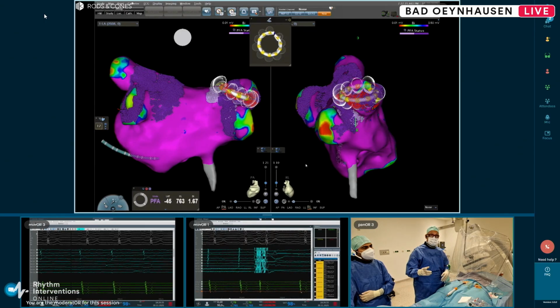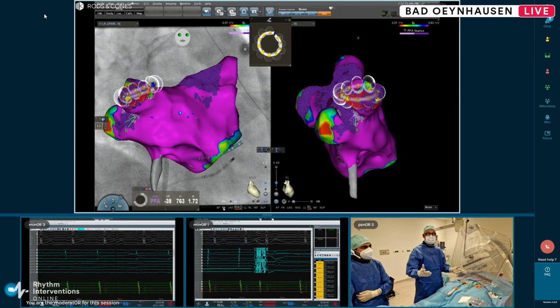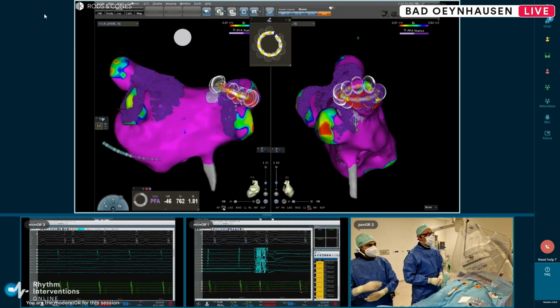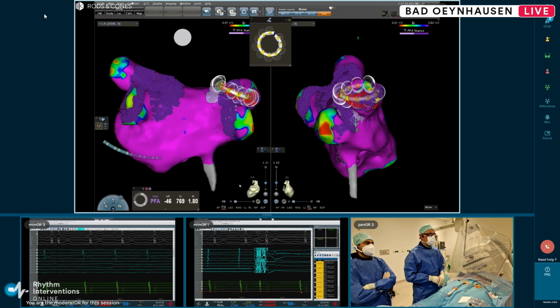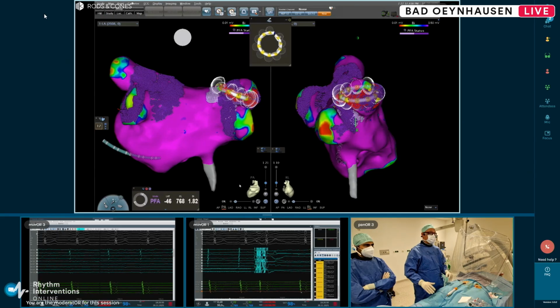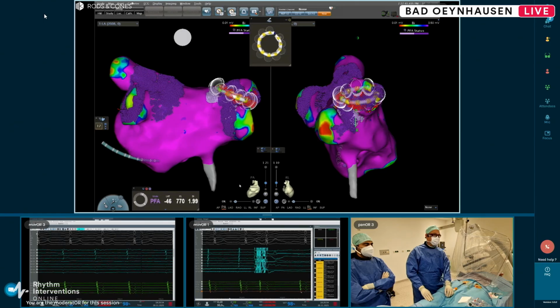And I also think what makes this technology so interesting is doing ablation in even complex patients, heart failure patients, where we see a lot of them. There we also use pulse field ablation, and the lower irrigation is, on the other hand, beneficial for them. So how much it matters is something we can discuss in a few minutes.